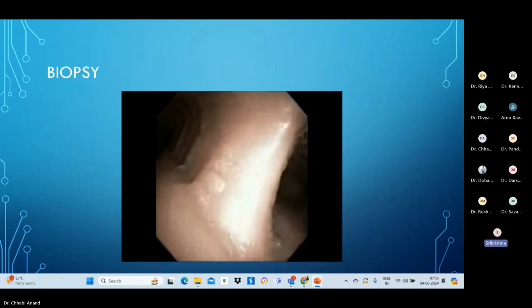How do you differentiate upper lobe from lower lobe? Like the bronchus is going upward. Your bronchus can get rotated. Somebody else can rotate your bronchoscope, and then the whole bronchus is looking like an inverted image.